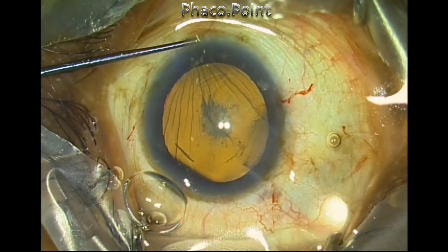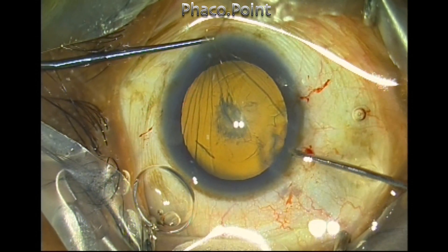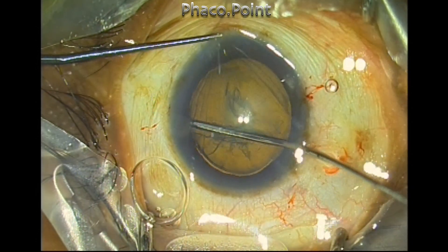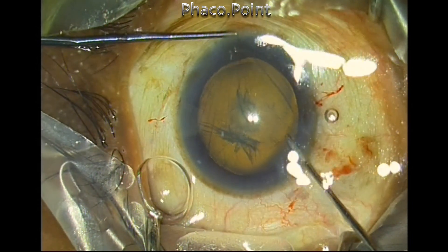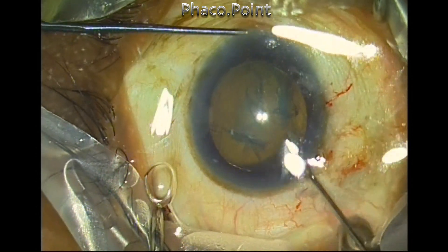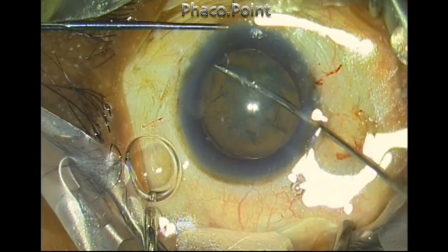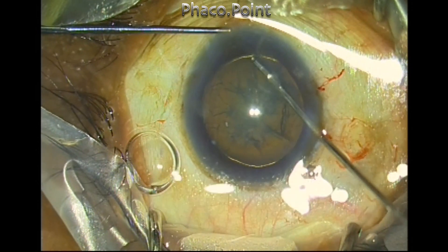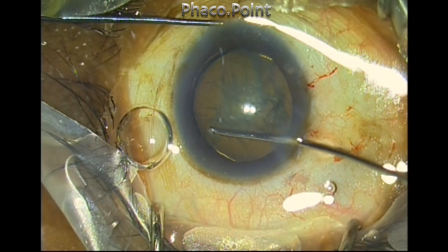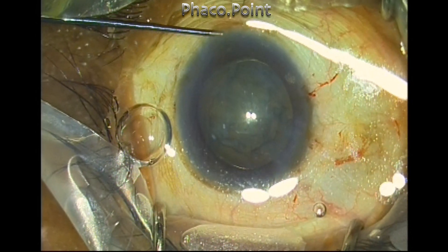This technique scores over tooth forceps and also the cotton-tip bud in order to get fixation of the eye, especially in patients who tend to squeeze a lot. Unlike the Thornton fixation ring, this is gentler on the cornea. It can be done in all cases where topical phacoemulsification is being performed because you are not touching the conjunctiva or holding on to the episcleral tissue at any point. With the help of this corneal pocket incision, like a magic wand, I'm able to hold the eye in the straight-ahead coaxial position throughout the initial procedures — the rhexis and hydrodissection/hydrodelineation.